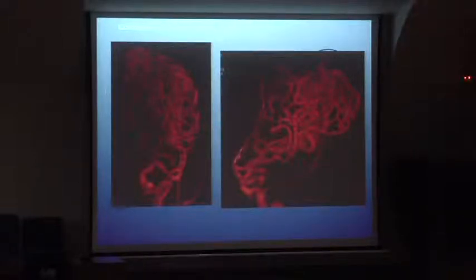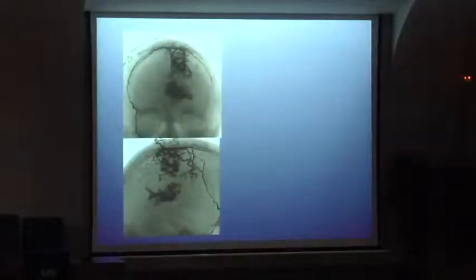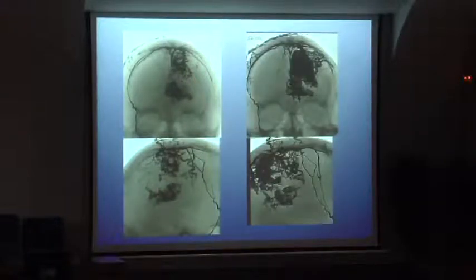Next. I'm going to navigate to this point. Next. In lateral view and AP view, you have only a small contrast in the AVM. I decided to put 8 or 10 vials of Onyx. Next. This is before embolization, the leptomeningeal is only with the anterior artery. Next, this is after leptomeningeal embolization, only with this small catheterism.